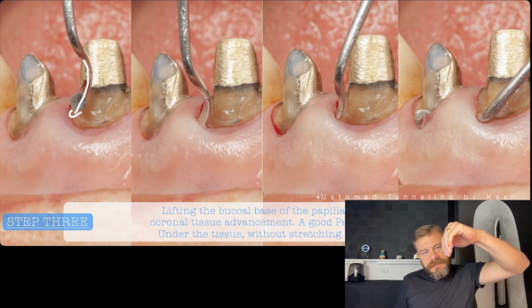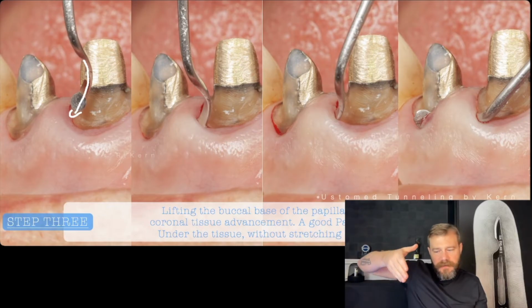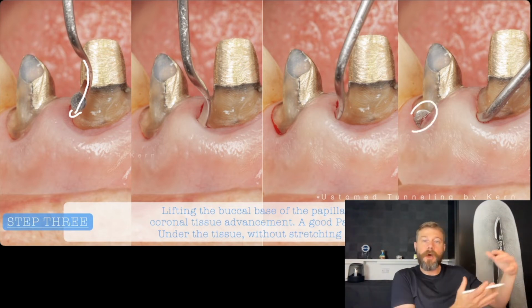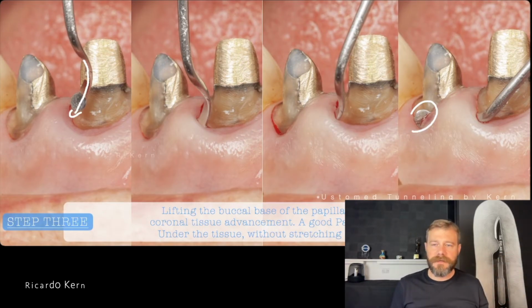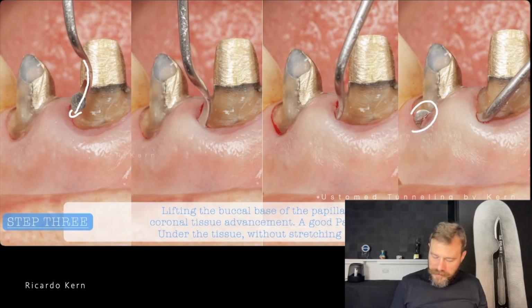in a very delicate way, and with the curvature of the instrument, the position of the active part can be exactly on the buccal plate of the bone, running under the buccal side of the papilla. You can even see this instrument emerging on the distal margin of the distal tooth, detaching the whole shoulder of the papilla, the whole buccal side of the papilla, with minimal stress on the sulcular area.